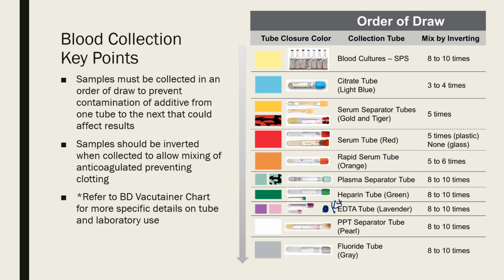So if you were to collect your chemistry tubes, which are in this section right here, and put that chemistry tube after your EDTA tube, then it could be possible that the EDTA potassium in that tube could get on your needle and contaminate your chemistry specimen.